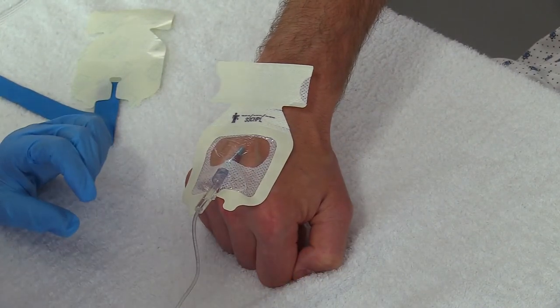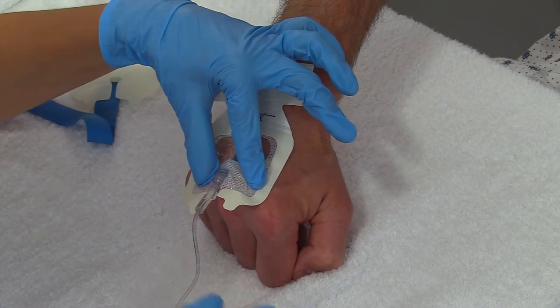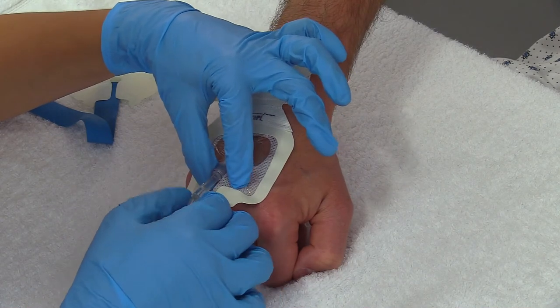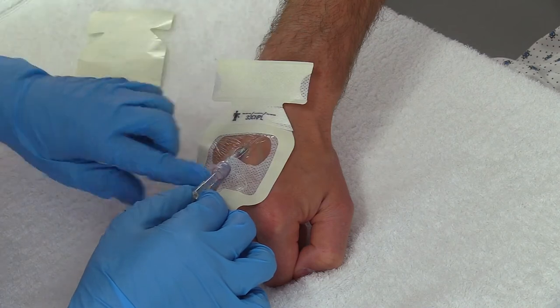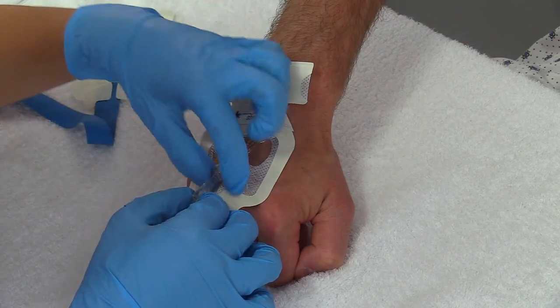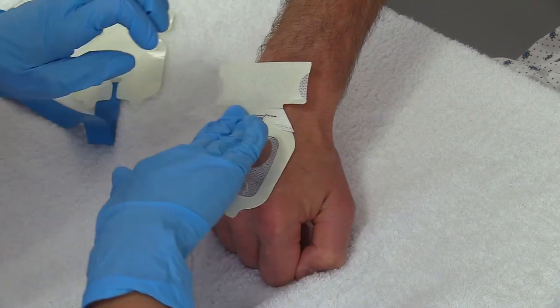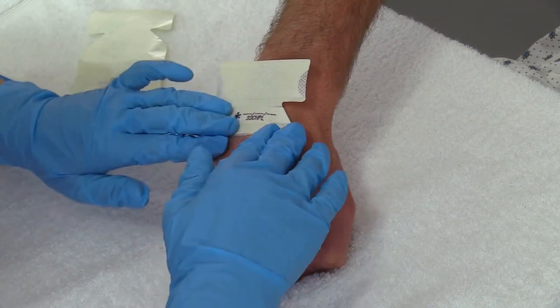Then I want to slightly compress these sides, and I'm going to just lift this tubing up a little bit because I want those notched parts to get underneath that part of the IV. So I'm pressing everything down, making sure it's nice and secure.